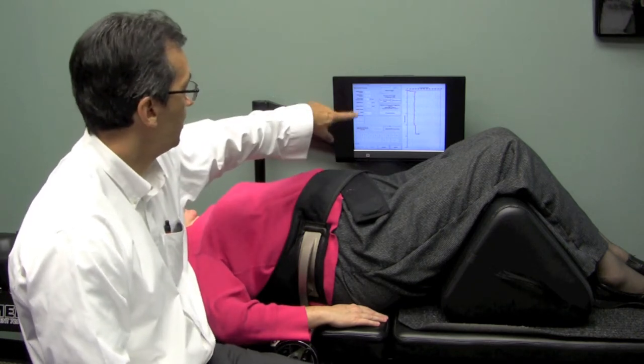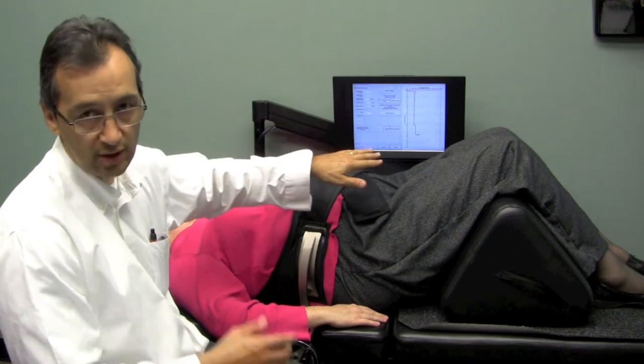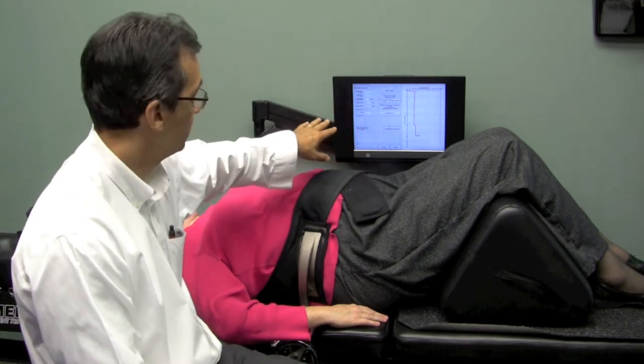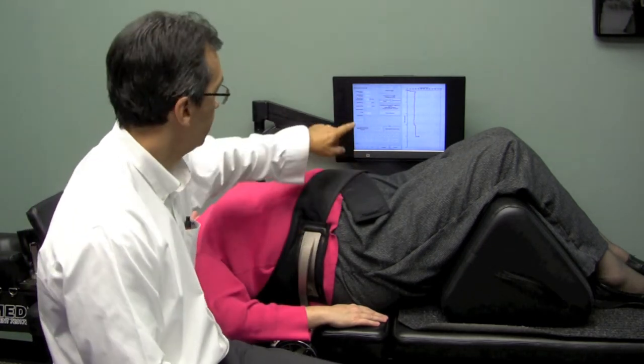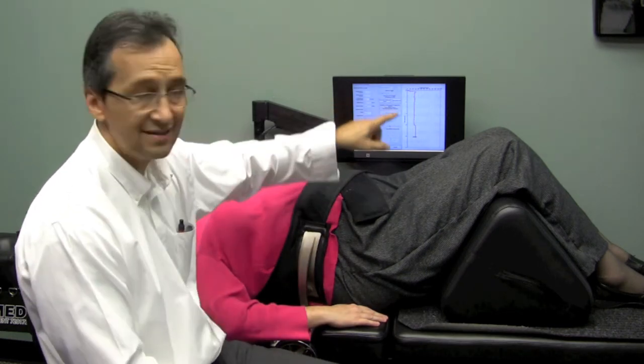The treatment is actually going on right now. This monitor right here is something that patients can watch. They're also welcome to watch TV if they prefer, but this is available for them on the monitor. This graph has the time — it goes for 30 minutes — and it also shows the tension.